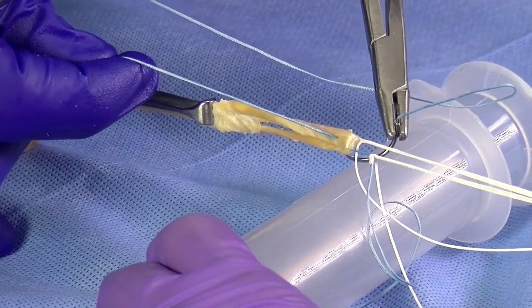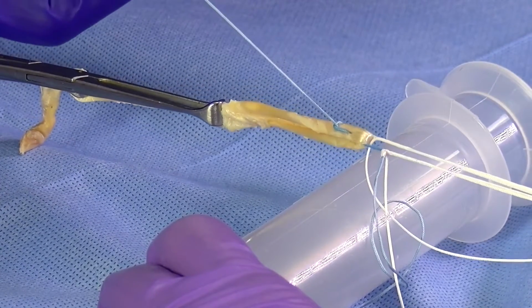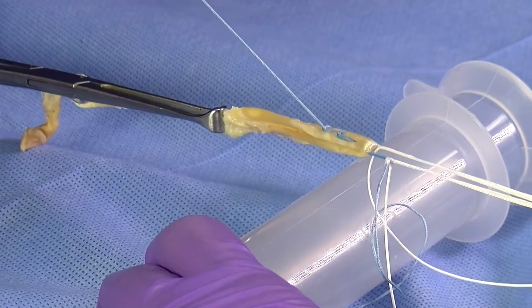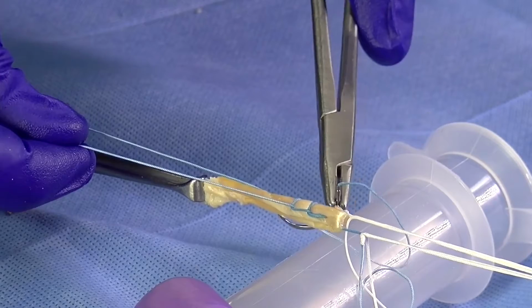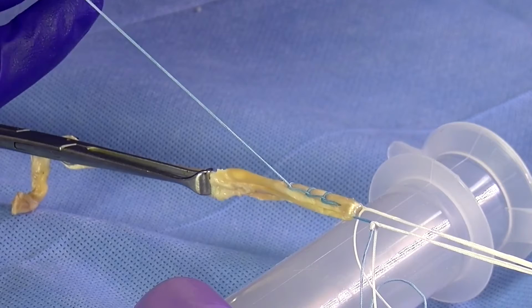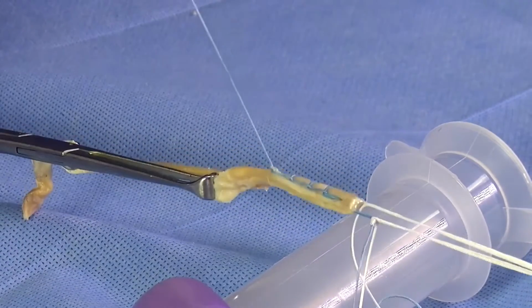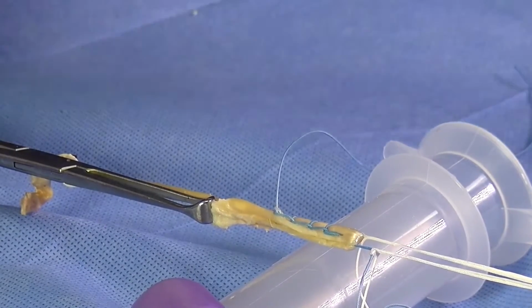This is my preferred technique because by doubling the tendon over, you create essentially a keyhole tenodesis. If you look at the literature on the history of biceps tenodeses, that's how they were originally done, a keyhole with a larger hole proximally and a smaller hole distally, and the tendon was balled up and seated in the socket, because they didn't have all of the fixation options that we do today.